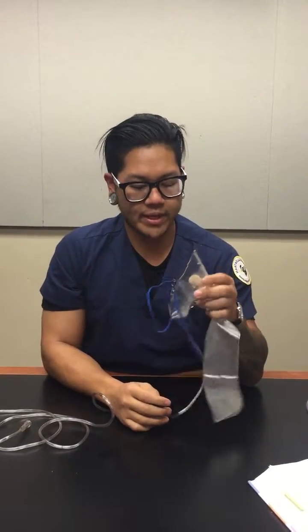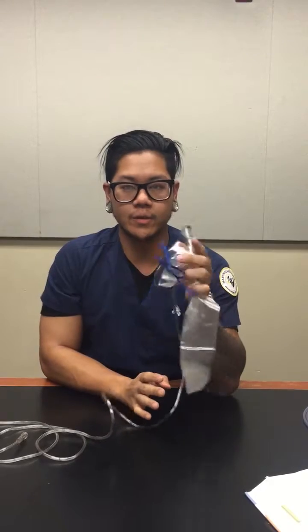And it's almost the same, but for a non-rebreather, it's also a low flow device, and the flow range is still a minimum of 10 liters per minute or higher to keep the bag from deflating. And the FiO2 range for this one is higher too, so it's 60 to 80%, and the FiO2 stability for it is variable. And advantages are just the same too. It's easy and cheap to use, and children and adults and infants can use it.